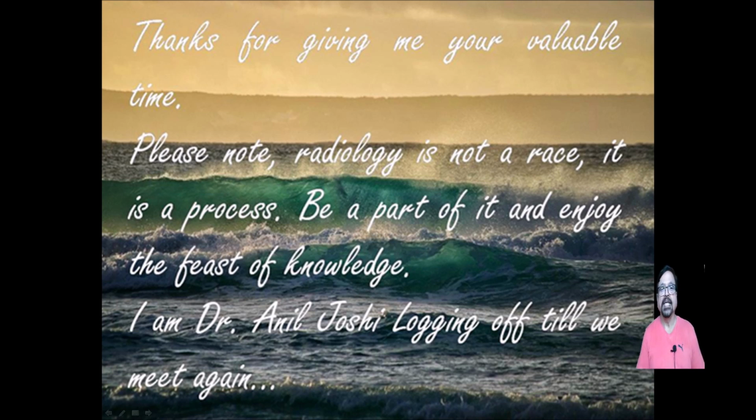With this, now we come to the end of this lecture series. We are going to have, as I said, multiple series. Every series will have some other different diseases, and it will discuss certain different techniques and pathologies. In this, till now we have seen, is there any role for barium enema, or is it an investigation which is washed away in the timeline. Personally, if we judiciously select the cases, there is still a role for barium enema, and it can give good information, but it is also true that it is technically difficult and the skill is getting lost as the days go by because it is not used frequently.